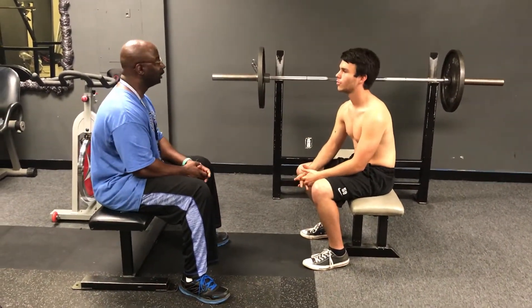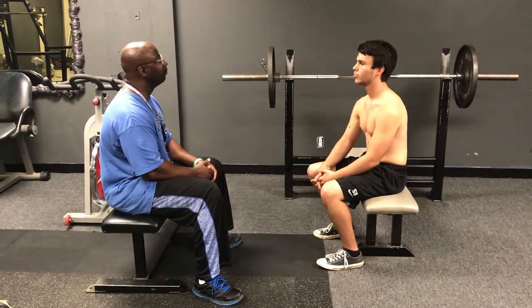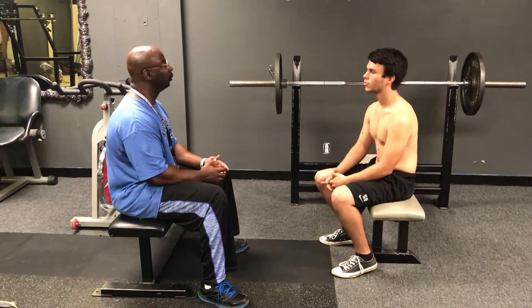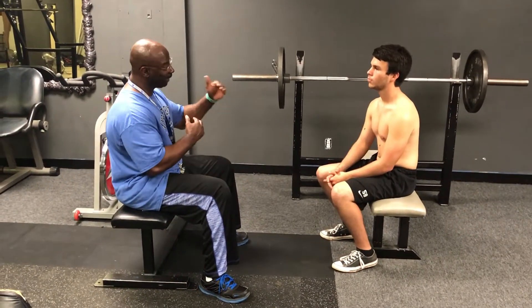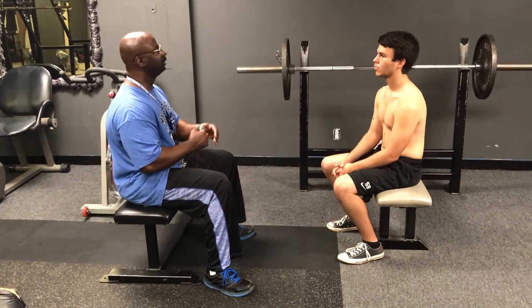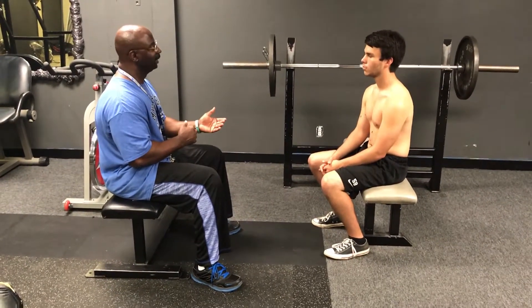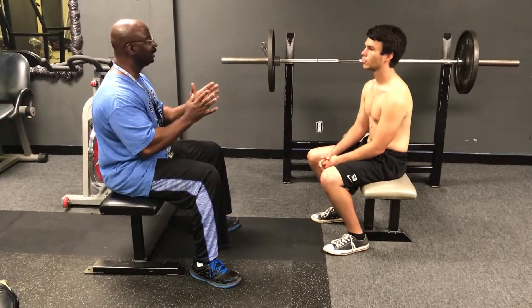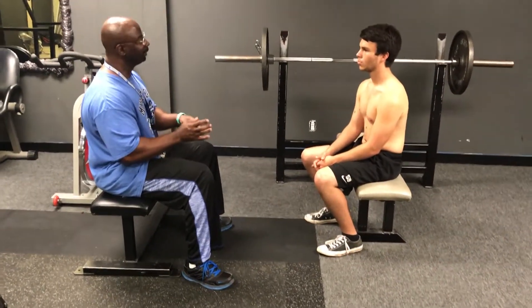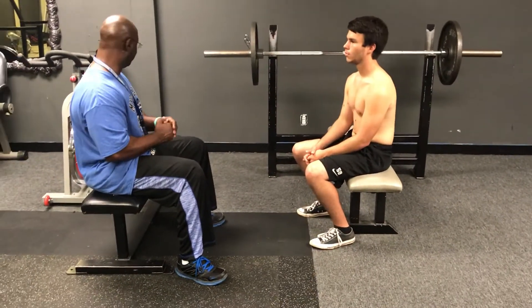What I'm going to do today is a skinfold test. A skinfold test measures your body fat. Knowing how much body fat you have is important because high body fat means increased chance for cardiovascular disease, hypertension, and type 1 or 2 diabetes. A good range of body fat for men is 10 to 22 percent, and for women, 20 to 32 percent.